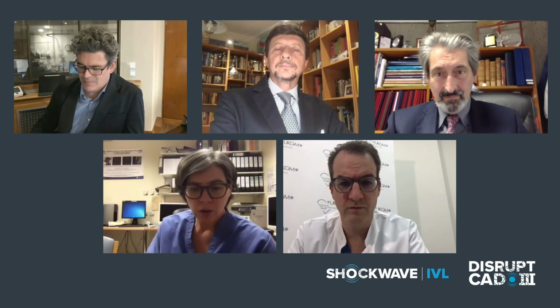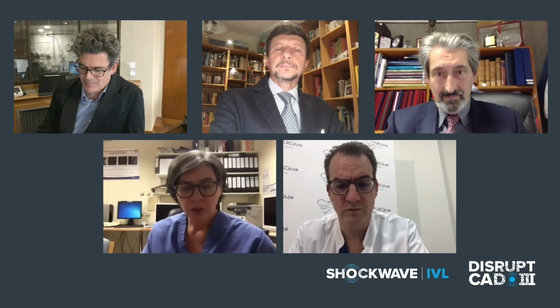Thank you, Holger. Margaret, what would be your message about how practice is going to change? So I agree with everything that Holger said there. I think that we now have a very accessible device to modify calcium, which means that calcific disease can be treated by a wider range of interventional cardiologists.